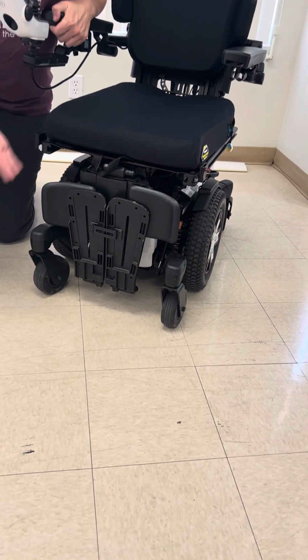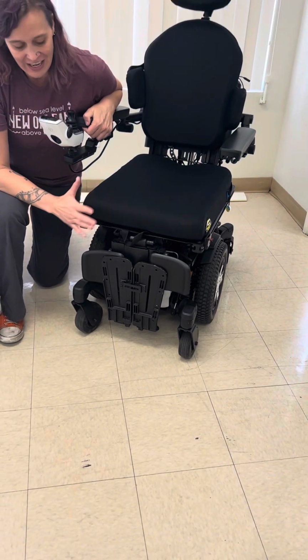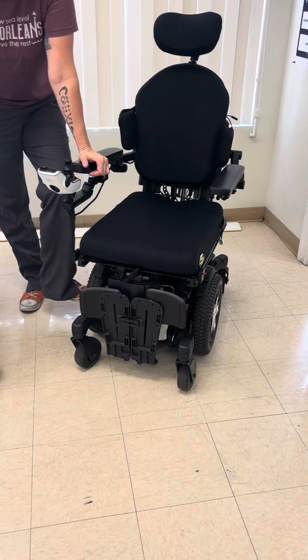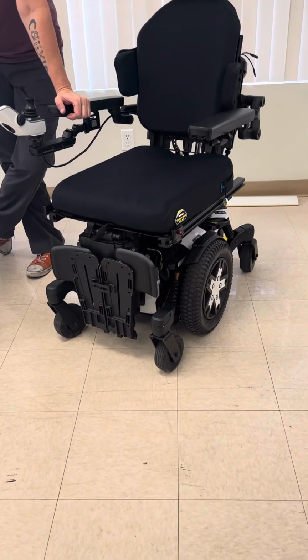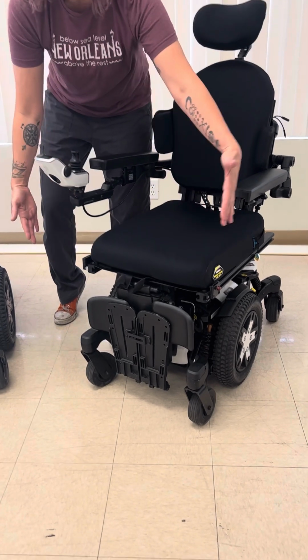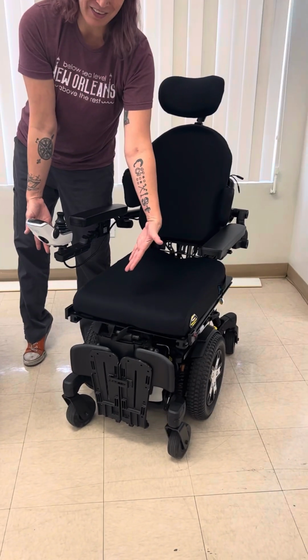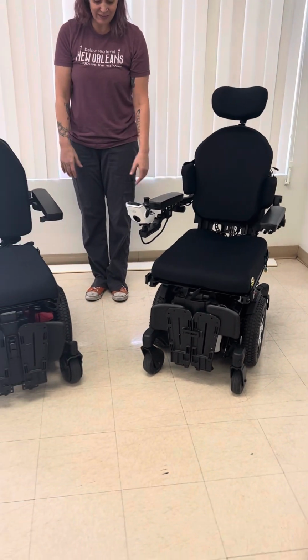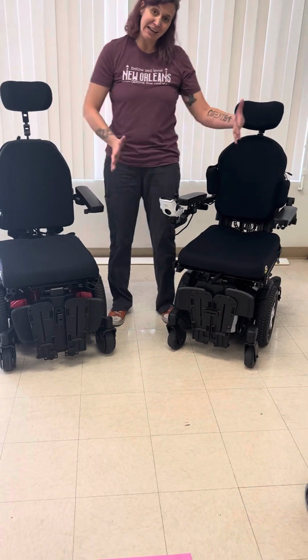There is another option with the Stretto, and that is to get a different size drive wheel. So if you get the smaller drive wheel, you can actually have the base an inch smaller, so 20.75 inches. But those are some of the key differences between that. So there is a narrow option.